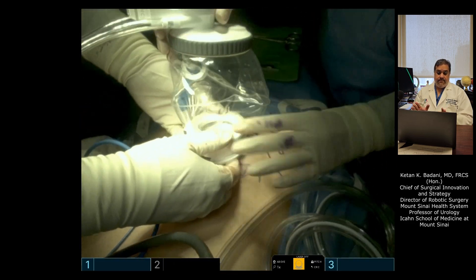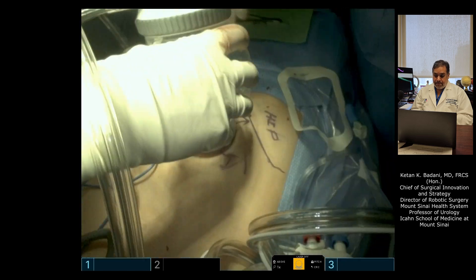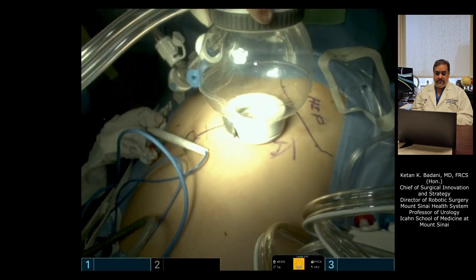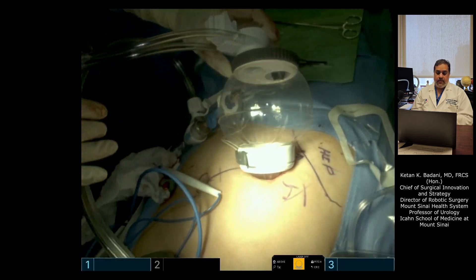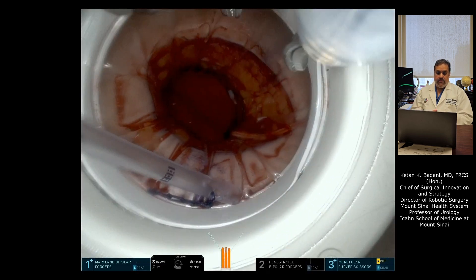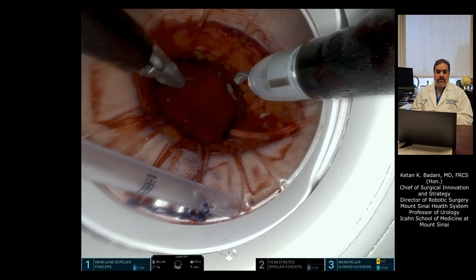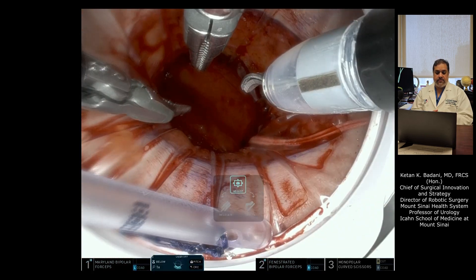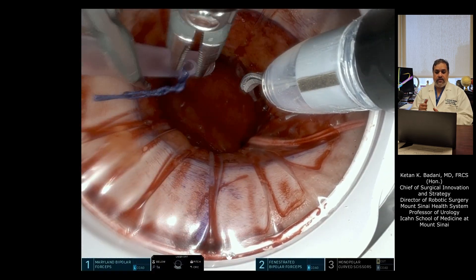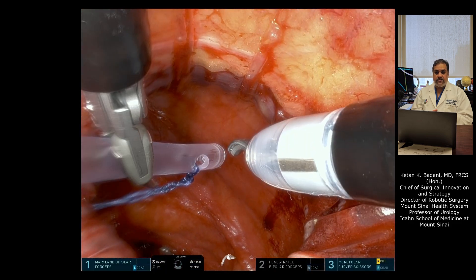That's it for the low anterior single port access. Whether you're doing the right side or the left side, it's exactly the same landmarks and exactly the same room setup. We're insufflating, creating our space, and we can dock the robot and start the operation. If you want to see the actual low anterior access partial nephrectomy, check out the other videos on the YouTube channel. Thank you, hopefully this was helpful.